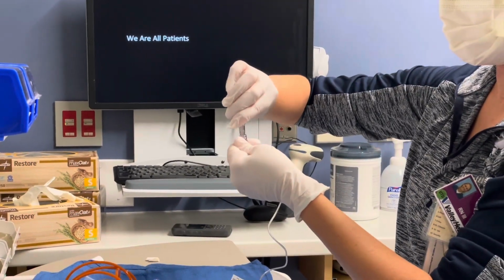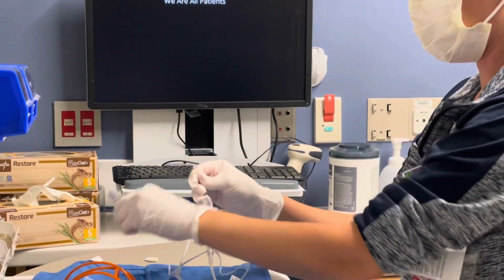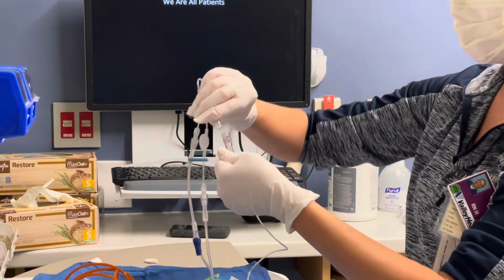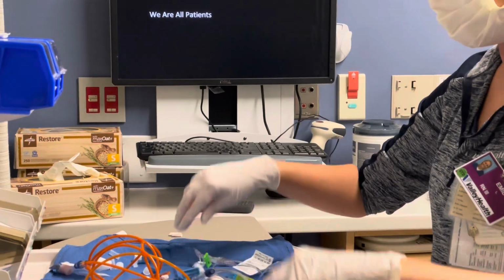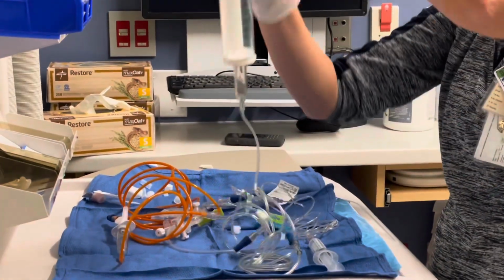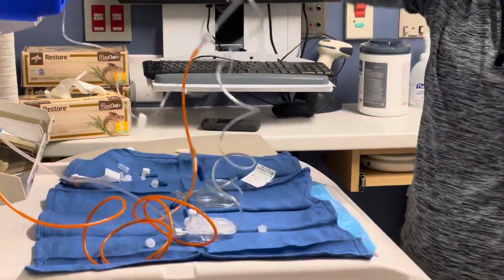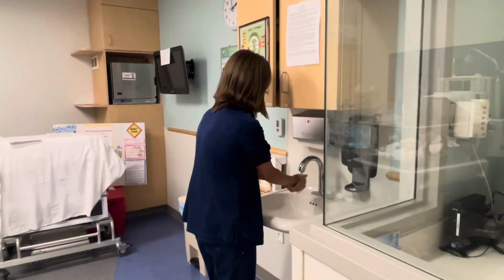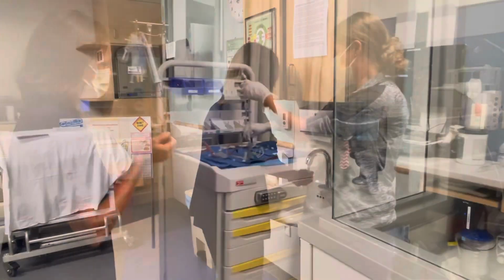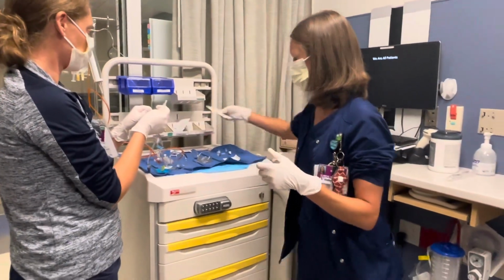As Emily has run all of her IV fluid through her IV tubing, she will wait for her second nurse to help her with changing out her IV tubing closest to the catheter. Serena will act as the second nurse, assisting Emily in changing her IV fluid tubing aseptically. She will scrub her hands for a full 2 minutes, has no watch or rings on, and applies a mask and gloves.